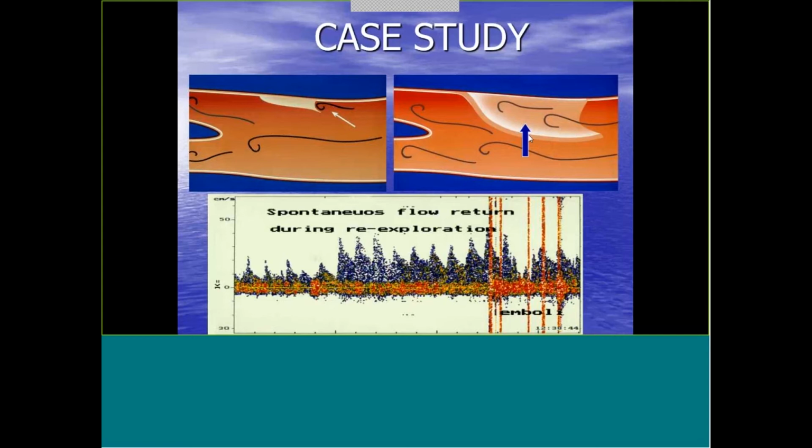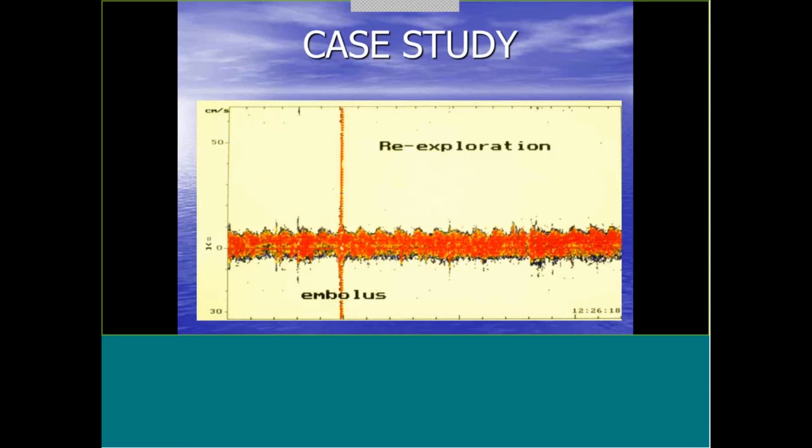Now, again, this happens at the end of the procedure. When we do carotid ultrasound in the recovery room, this is what the surgeon is looking for. They're looking to make sure there is no flap dissection, because when you ultrasound the carotid artery post-op, you can see, is there any abnormal lumen hanging down there, okay? But with TCD, you can tell this complication at the end of the procedure. So this is what was happening with re-exploration. You see how low the velocities were, and they're now very truncated.